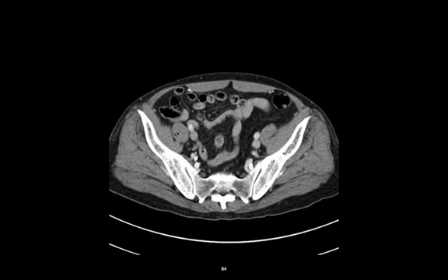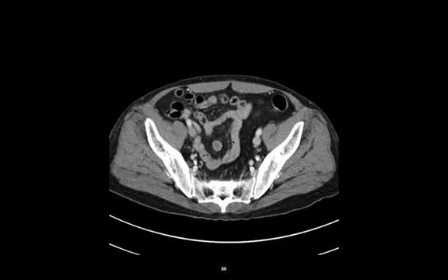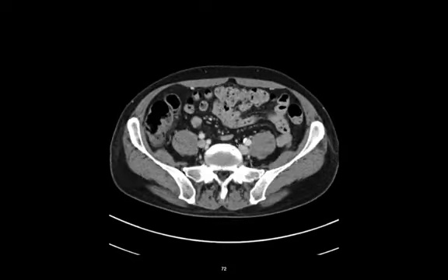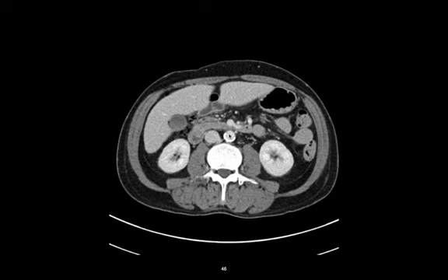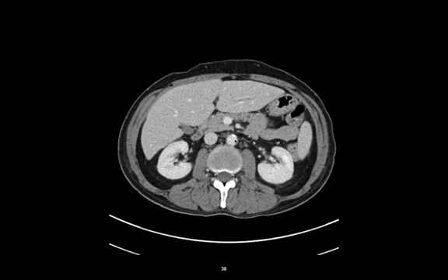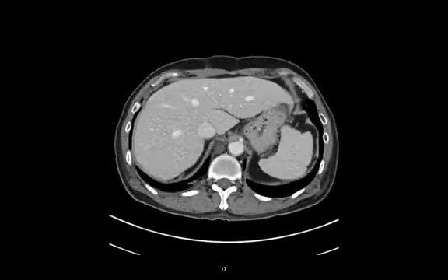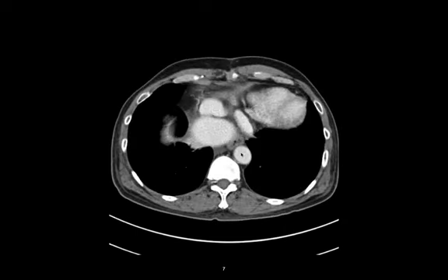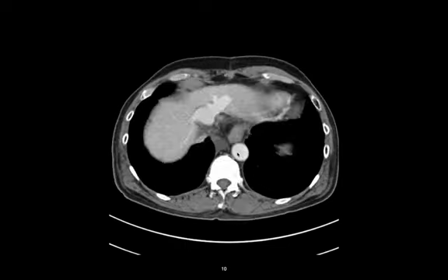All right, let's go to the cardiovascular system now, shall we? And let's talk about the aorta. So I'm going to go back up, and we're going to see right in the ventral part of the vertebral body, to the patient's left is the abdominal aorta. On the patient's right is the inferior vena cava. Okay, so if we follow this abdominal aorta all the way up, we're going to see the vessels coming off. So there's our left and right lungs. So let's follow the abdominal aorta.